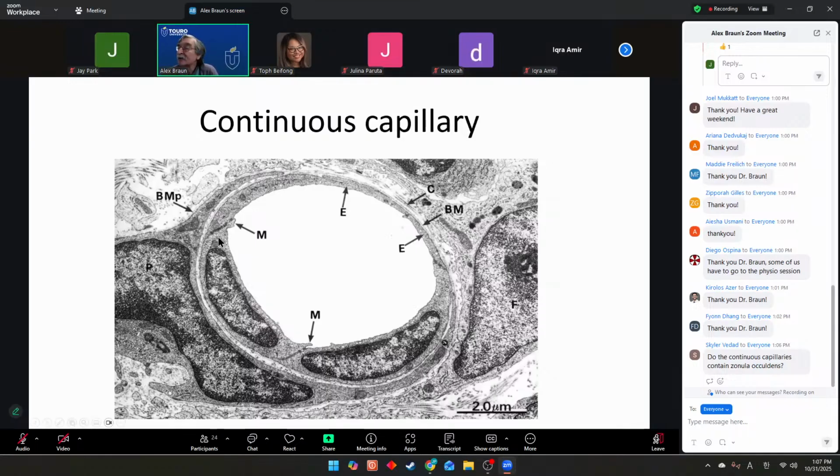Another thing you see in this picture is that at the junctions between endothelial cells, you see some dark staining. This dark staining is the junctional complexes, including adherens type junctions between endothelial cells. So that dark staining reflects these junctional complexes. There's also a little bit of a protrusion of endothelial cytoplasm into the lumen here. That's a so-called marginal fold. So I see some marginal folds right here where there are cell junctions between two separate cell processes.